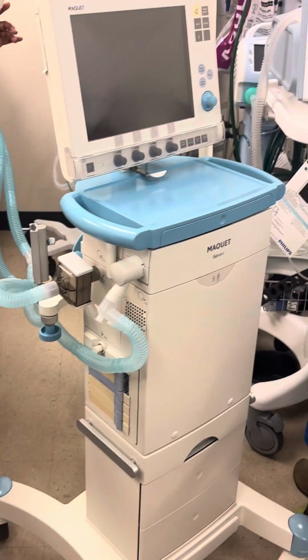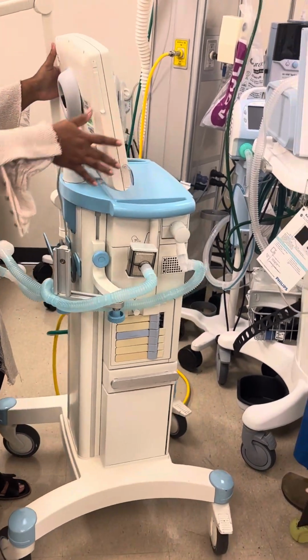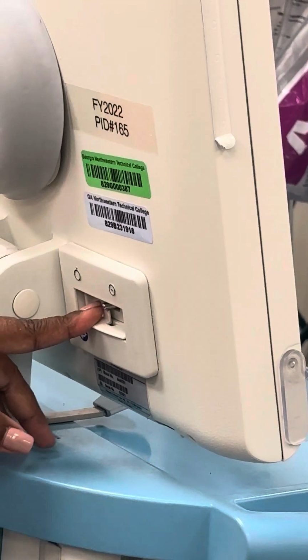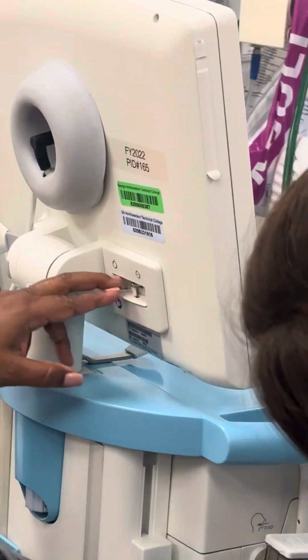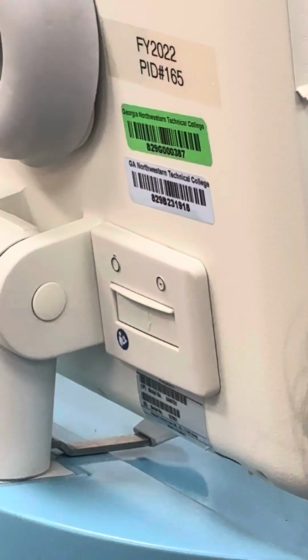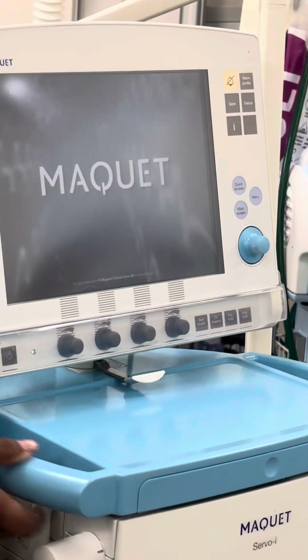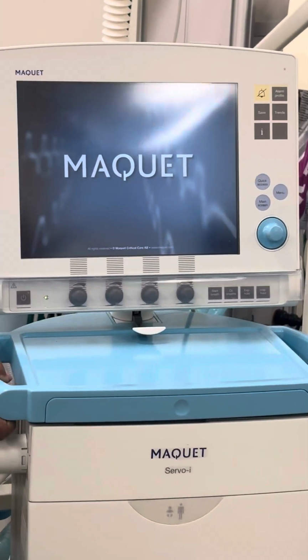The on switch is in the back of the ventilator. I can't show you that, but it's like a little panel right here. Everybody see this? All right, so when I actually click it, Sky and Marissa, y'all come around so y'all can see this. It's like a little silver, everybody see that little silver notch? So this kind of pulls down and it locks it when it's off, all right? But if I'm gonna turn it on, I'm gonna take this and it flips up. And then your ventilator comes on. And it should come on with a name. Thank you, honey. All right.